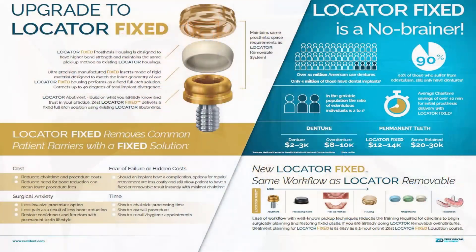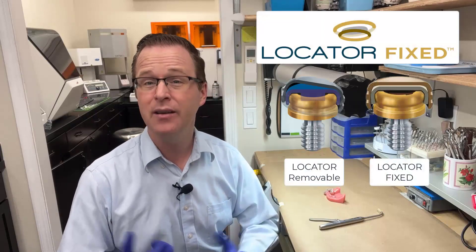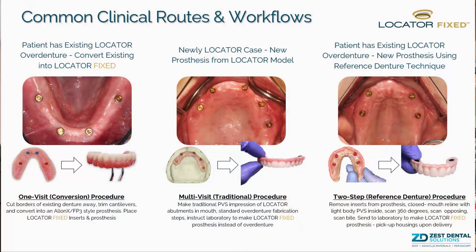Since locator fixed doesn't use any sort of screws to hold that prosthesis in place, it relies upon a very precisely engineered locator housing and locator fixed insert — very similar to what you would see with locator removable restorations, housing and insert interface. Clinically, locator fixed should have a very similar workflow as your locator removable situations, except that the locator fixed prosthesis shouldn't have any flanges. It should be a true hybrid fixed full arch solution without flanges, like an overdenture.